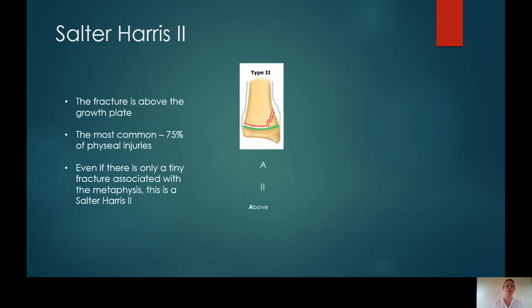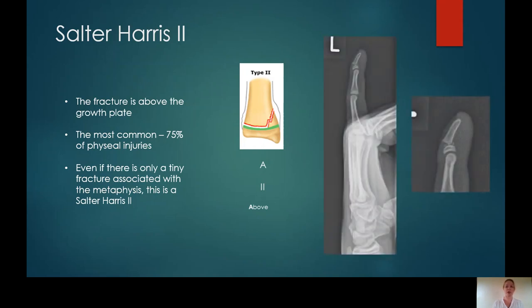Salter-Harris type 2 is the most common Salter-Harris fracture, involving approximately 75% of these physeal injuries. Even if there's just a tiny fracture fragment that has arisen from the metaphysis, regardless of how displaced the epiphysis is, this is a type 2 fracture. On this lateral finger, you could easily think this would be a Salter-Harris type 1 fracture, but zooming in you can see the metaphyseal fragments — so this is a displaced Salter-Harris type 2 fracture.